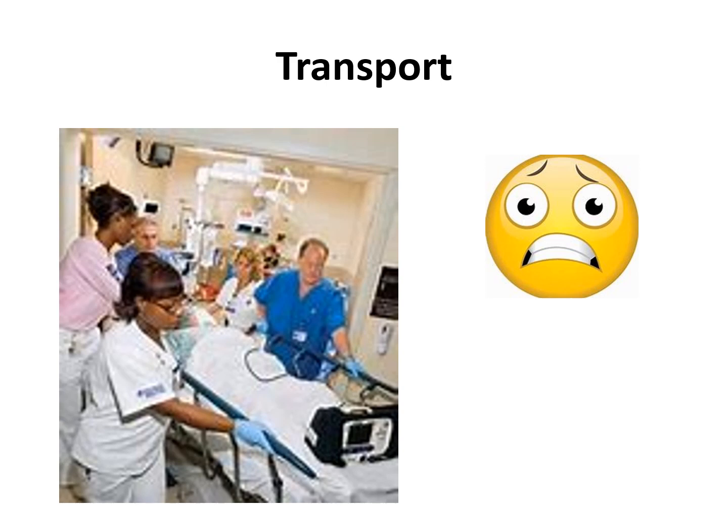Equipment, you're going to need monitoring equipment, so you need the monitor. Again, hospital-specific guidelines, so not only the cardiac monitor, you may need pulse oximetry, you need a portable ventilator, you need a BVM or Ambu bag. You may need some patient-specific items such as medications. So these are all things that, when transporting, can be very difficult and very stressful.